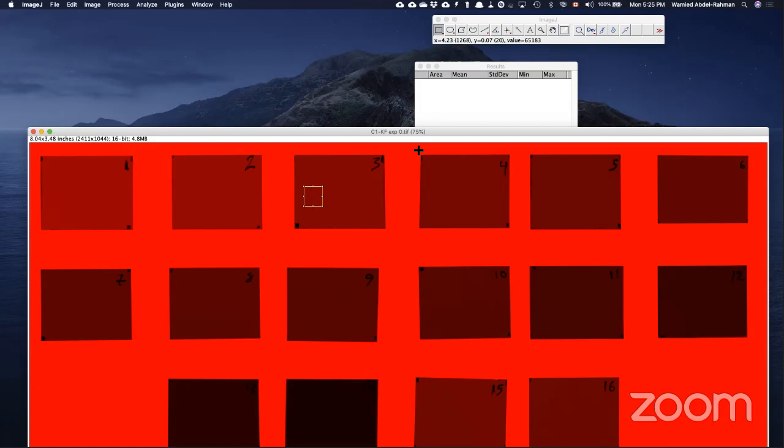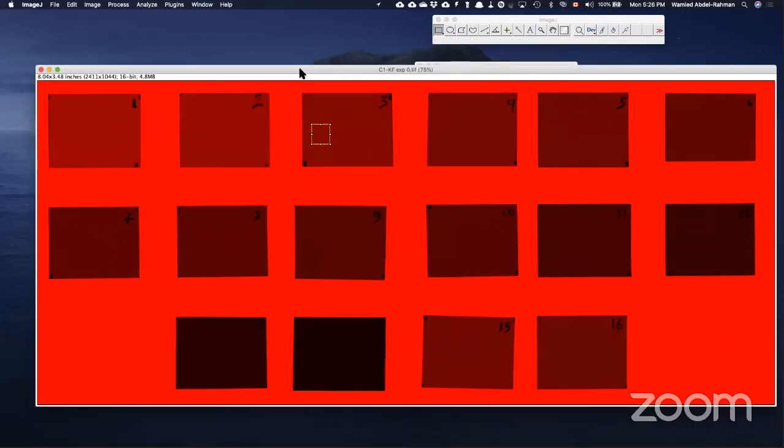But he told me that actually this issue of film or scanning orientation has been fixed for films, because that used to be a big disadvantage, and one has to be very cautious, handling, making sure you're consistent with scanning orientation. Suppose you're doing the calibration, okay? I cannot scan some films in this direction and the others in this direction, because the backgrounds are going to be different and the signal is going to be different. So we have to be consistent.